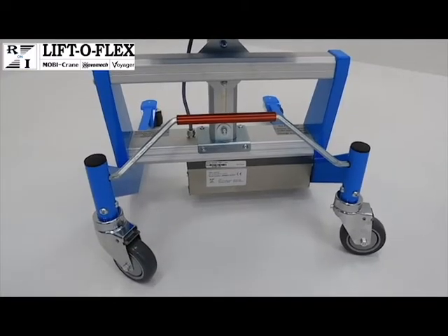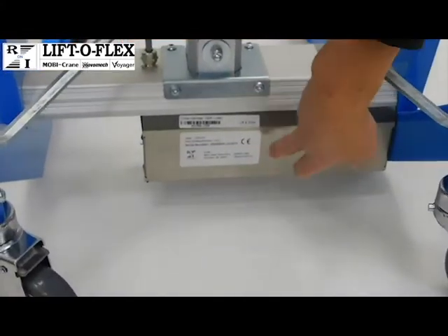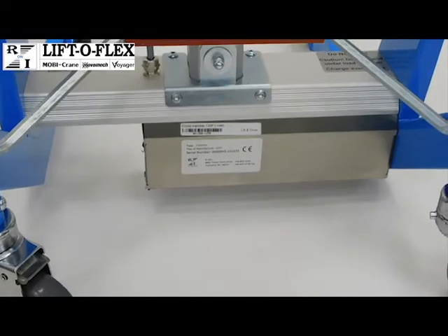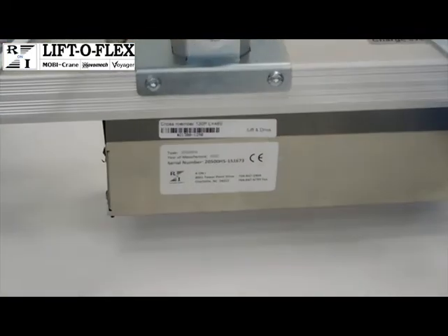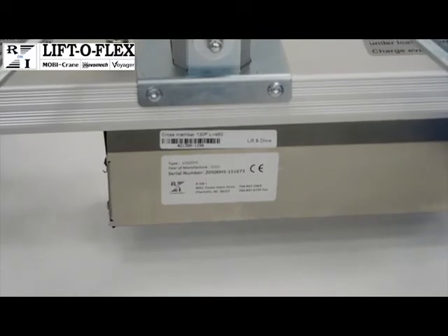The lifter serial number, the main one, is located here at the bottom back of the lifter. It's on the Roni sticker there. That serial number is the main lifter serial number and will tell us everything about the lifter.